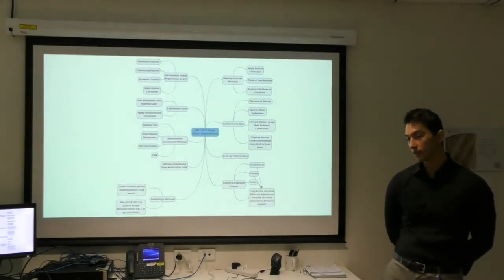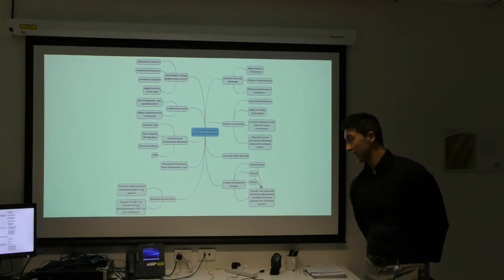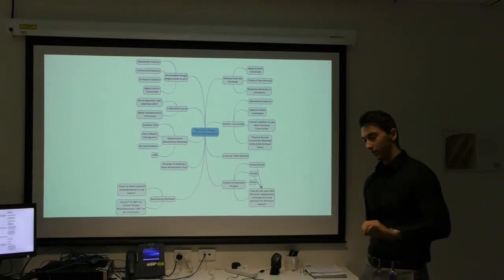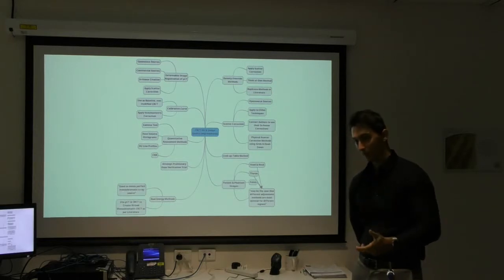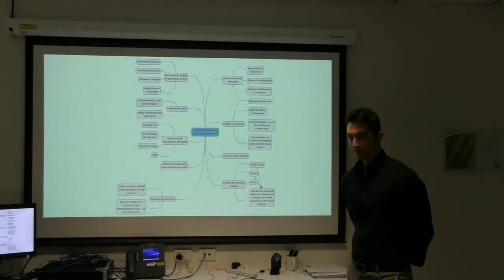But yes, motion artifacts cause double contours, or, I don't think it was evident in the image, but for example, bowel movements, gas trapped in the bowels, that again is involuntary, and it creates streaking artifacts because the reconstruction algorithm assumes that the patient is static, obviously, and that every photon ray passing through the patient corresponds to a static anatomy. But when it changes, that obviously messes things up in the reconstruction phase, and it results in pretty nasty streaking artifacts. So do you know why the CBCT takes a minute?